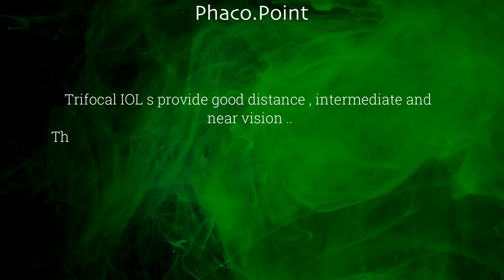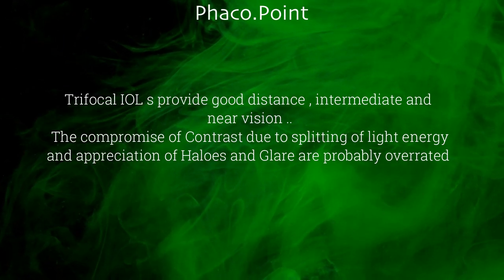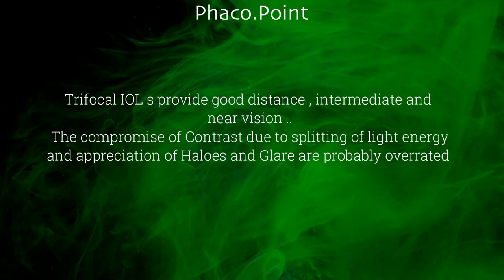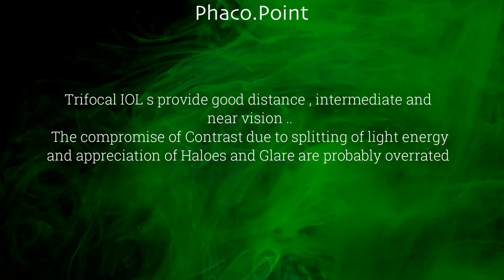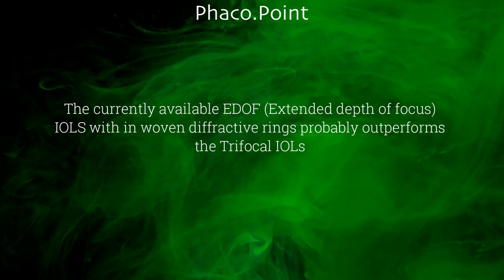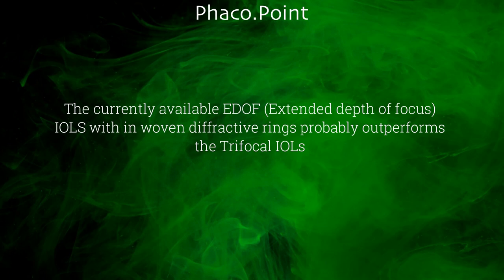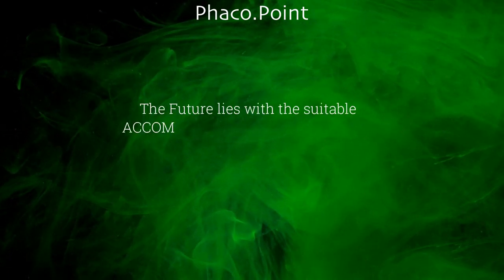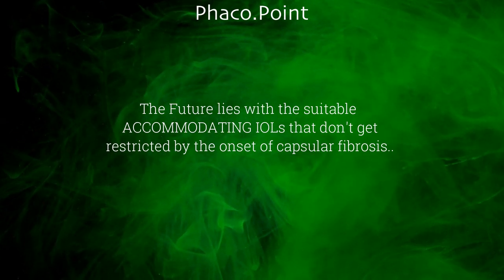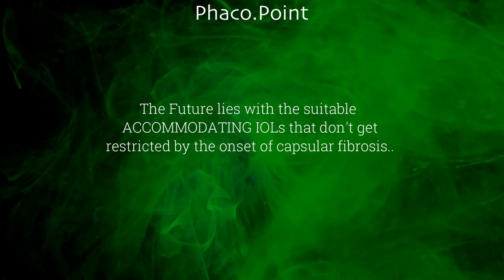Trifocal lenses are a boon to us because they give us excellent distance, intermediate and near vision. Probably the drop in contrast and the complaints of halos and glare is a little bit overrated because they tend to decrease over a period of time. Now currently we have extended depth of focus lenses with inwoven diffractive designs that probably outperform the trifocal IOLs. The near future would probably see the introduction of accommodating lenses that do not get restricted by the onset of capsular fibrosis and behave like a natural human crystalline lens.